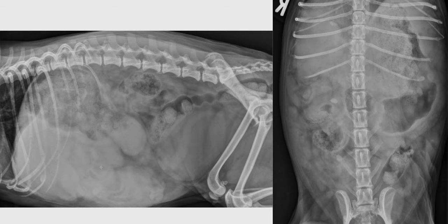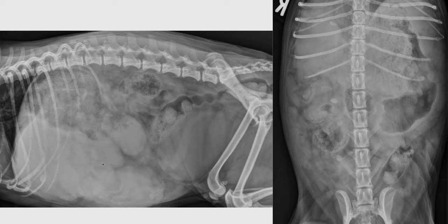There is another finding in that radiograph: there is also a soft tissue opacity mass lesion here in the cranial to mid ventral abdomen. And we do not see really well the normal margins of the liver. Normally the liver appears as a soft tissue triangular, well-defined soft tissue opacity at that level, but here we don't really see what is liver and differentiate it from this mass lesion.